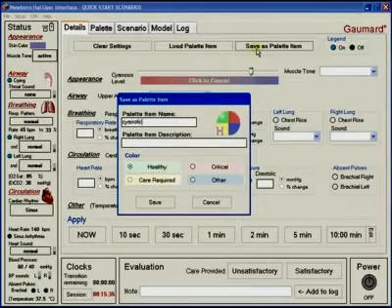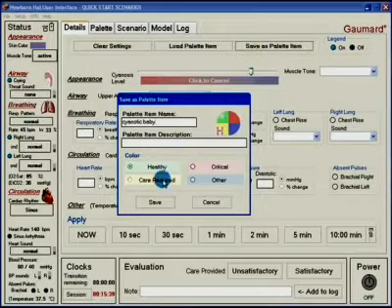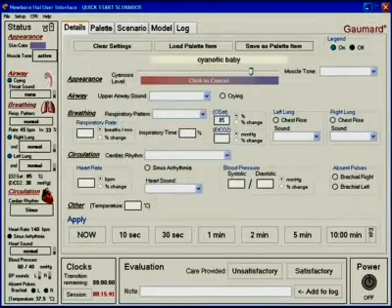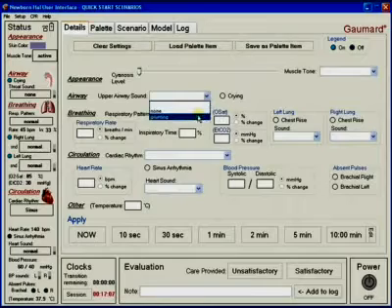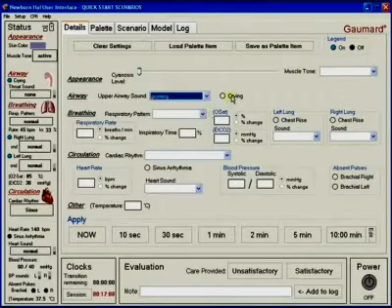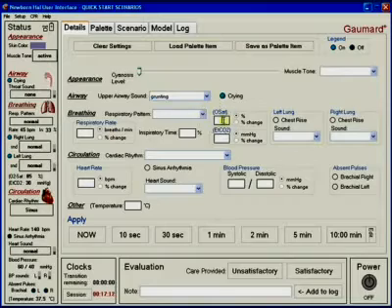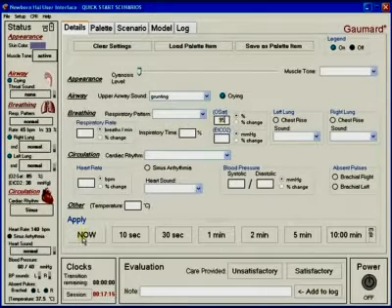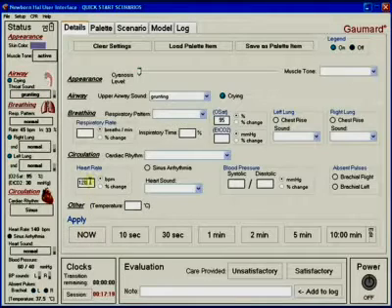The parameters are selected using the drop-down menus, three state switches, and integer boxes on the details page. They can be applied to take immediate effect or trended to change over a set time period.